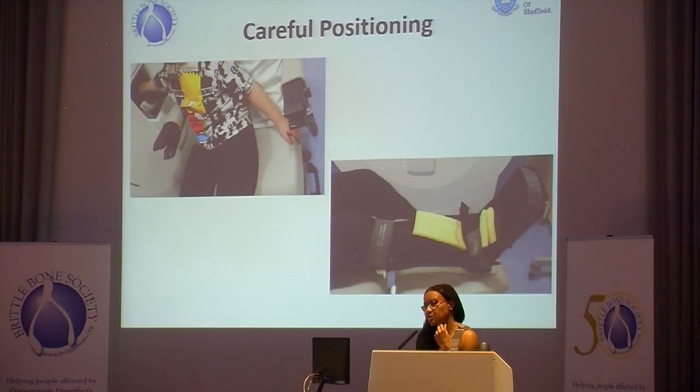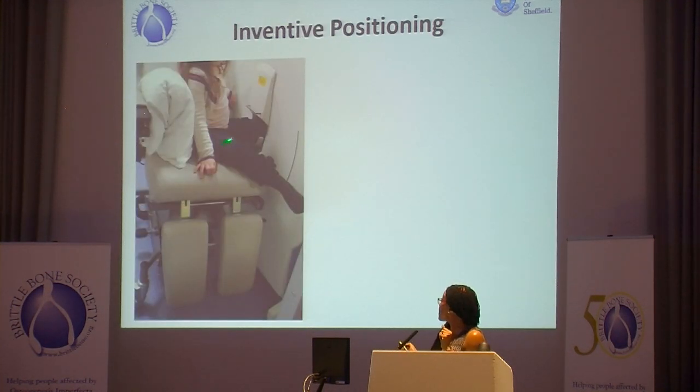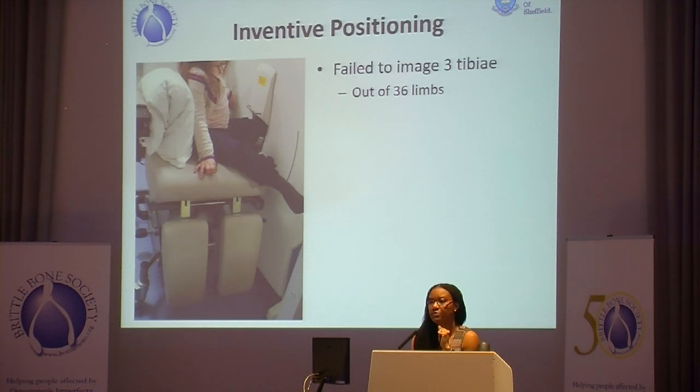You need to position them pretty carefully because we don't want to cause a fracture, and also they have to keep still for about 3 minutes, which, well, children, 3 minutes is forever, really. So very difficult, but with the padding, we did manage to succeed most of the time. This little girl couldn't sit on the chair with the extension, so she's on the side of the chair with the pillow behind the arm and got her leg in, but we were successful. We only failed for 3 ankles out of all 36, so that was pretty good.